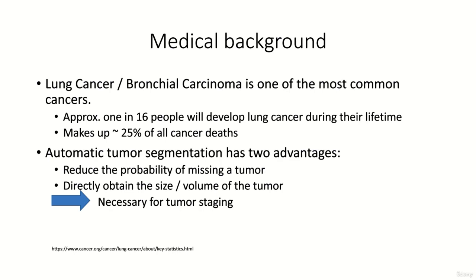Automation of this process offers two main advantages. First, it may help to reduce the false negative rate. In addition, it directly provides an initial size or volume estimate of the tumors. As the tumor volume is an important criterion at the tumor board, this automated segmentation simplifies the radiologist's life as he or she no longer has to segment the entire tumor but only make corrections.